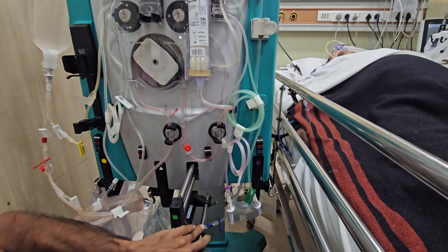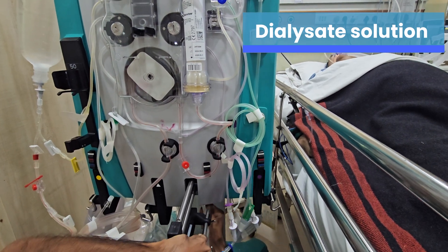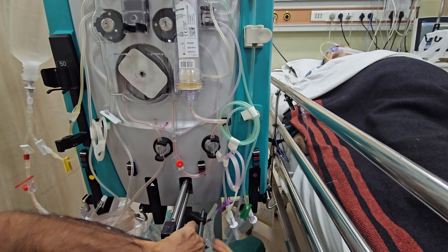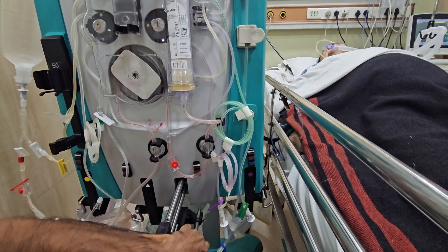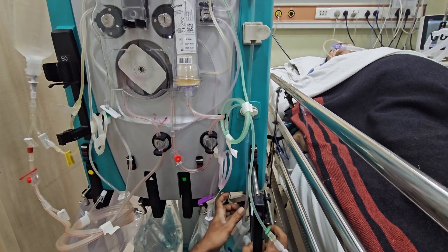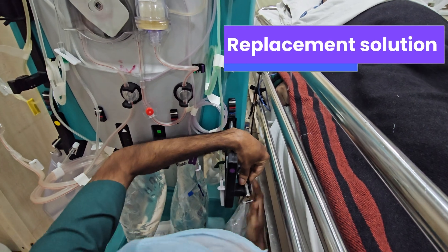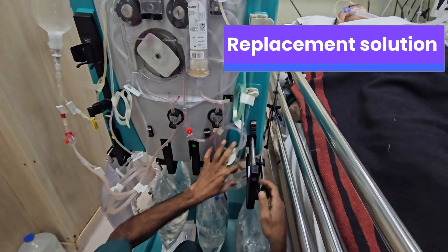Load the dialysate bag. Replacement fluid bag is prepared. Pull the purple scale.